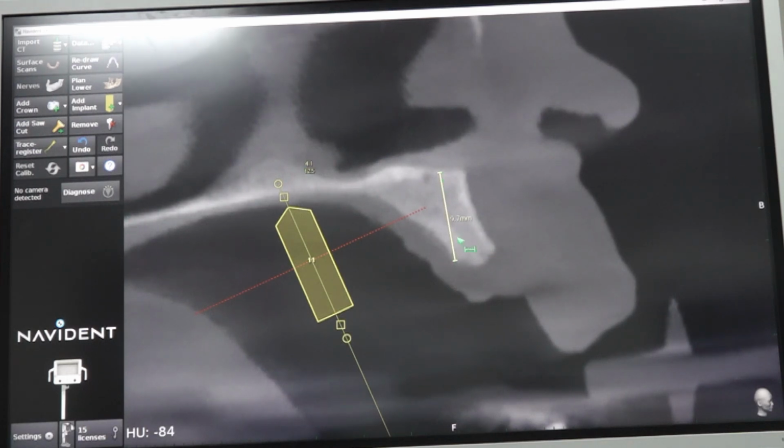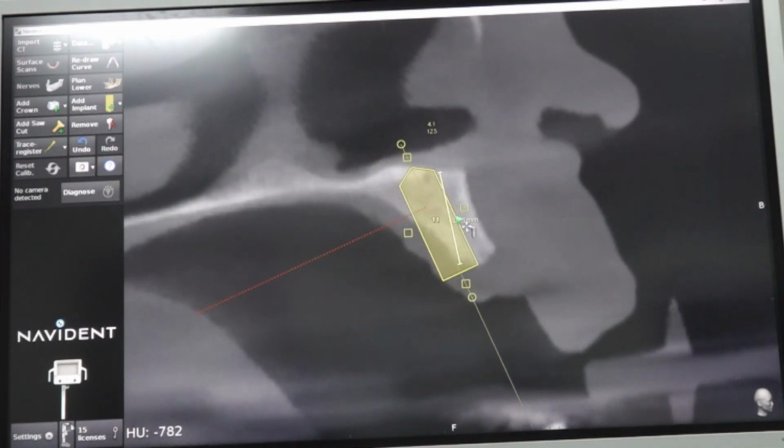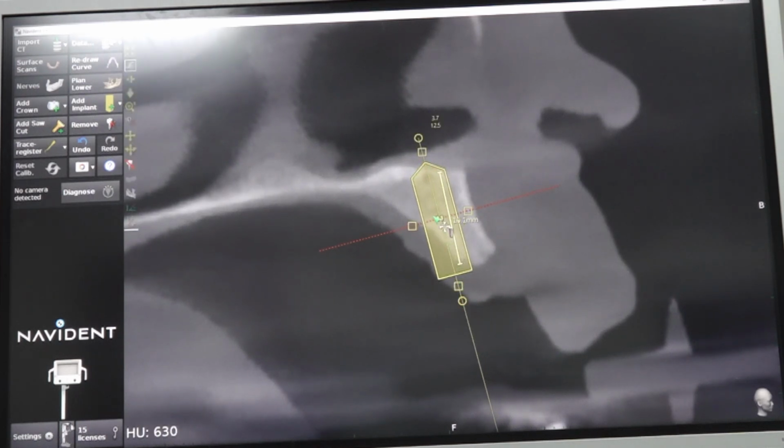So what we do is we do the palatal approach, so that 3 mm bone will be on the lateral side. Palatally it will be protected by this palatal soft tissue, which will be like the mother. This bone will be like the father. They will protect this implant child. Okay. So better to select a smaller diameter, 3.75. Already less bone, why select a bigger one? So completely palatal approach, or we can place a BCS.